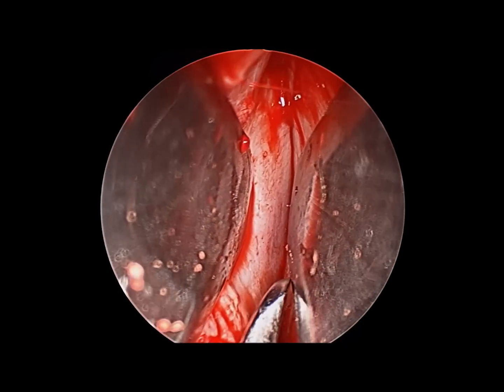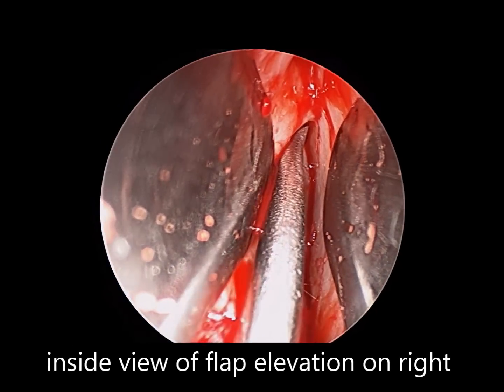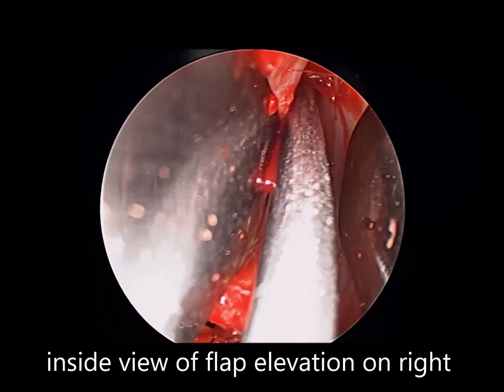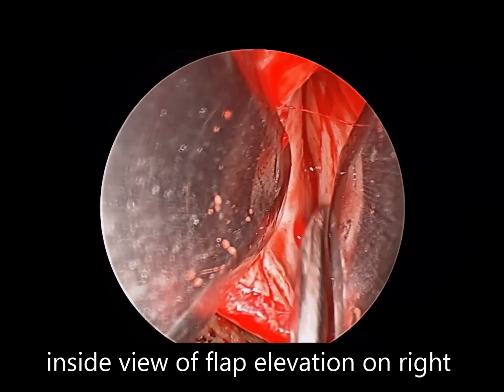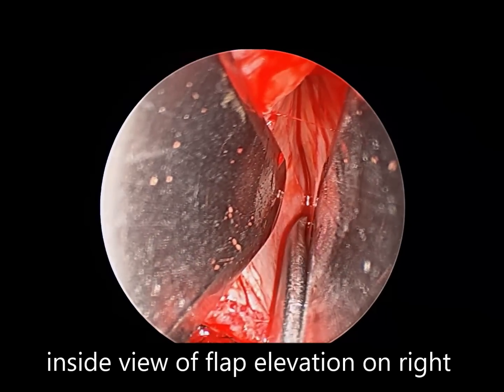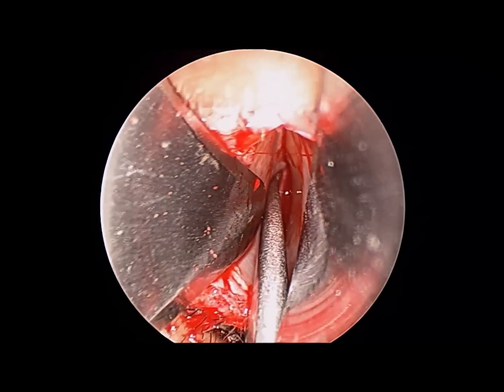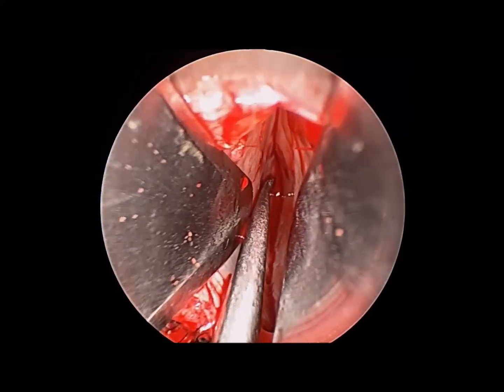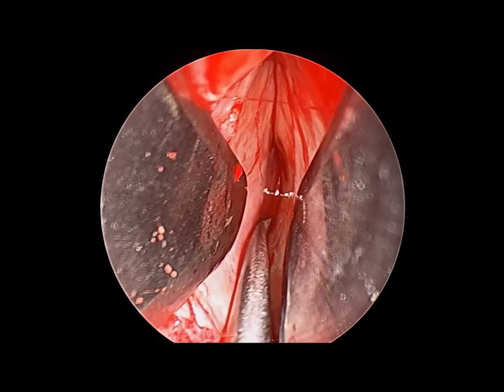I typically perform septoplasty with a headlight, though for the purpose of education here we have an endoscopic view showing exactly what takes place below the mucosal flaps. This is dissection from the patient's right side, so their septal cartilage, which is soft but more firm than the mucosa, is on the right side of the screen, whereas the mucosa that we're elevating away from the cartilage is on the left side of the screen.